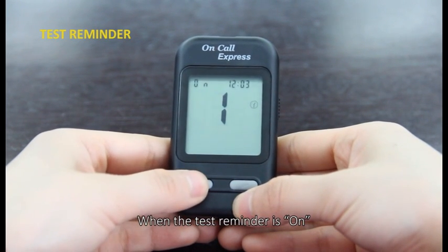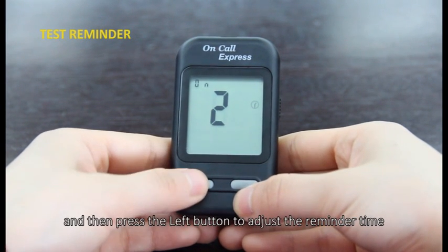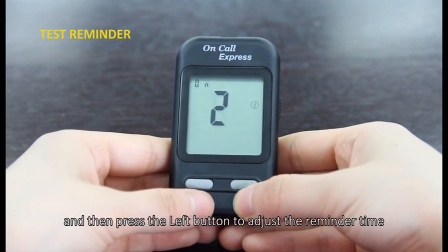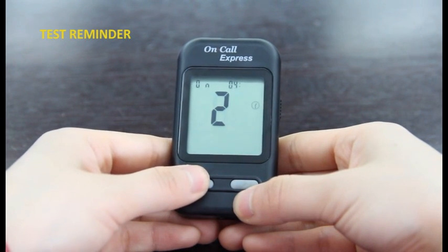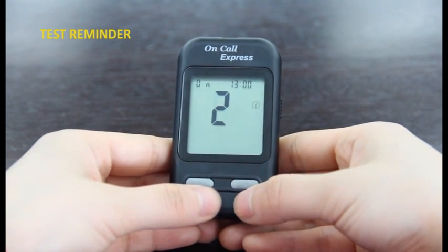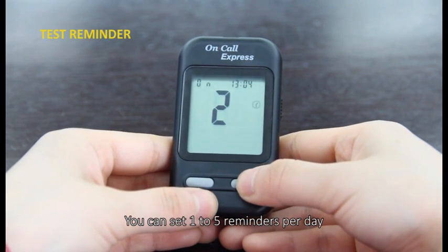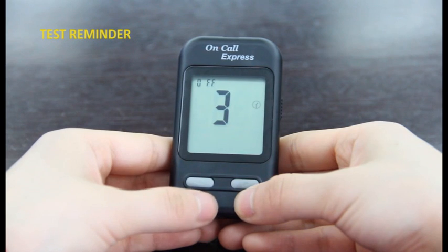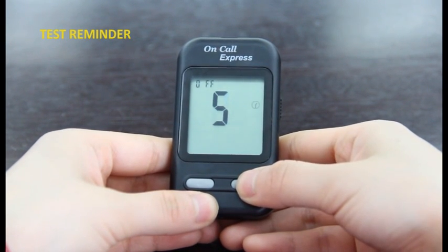When the test reminder is on, press the right button and then press the left button to adjust the reminder time. Press the right button to save your choice.